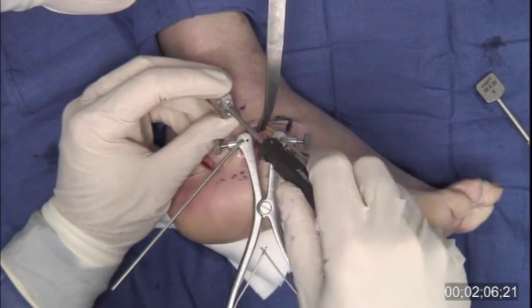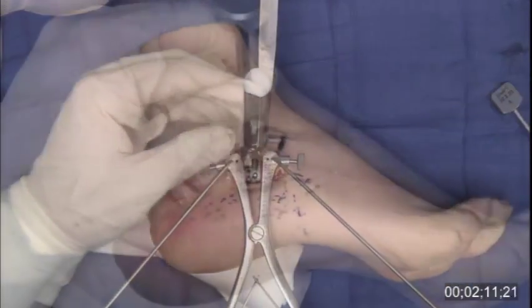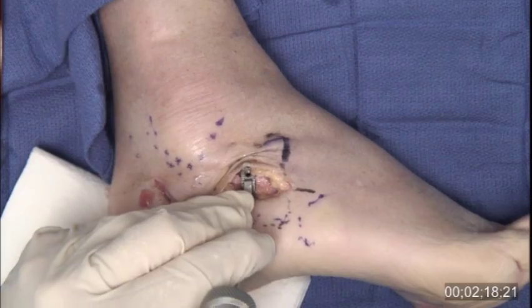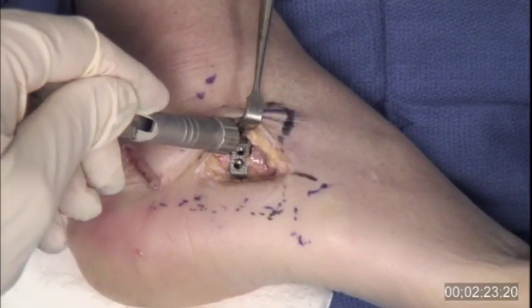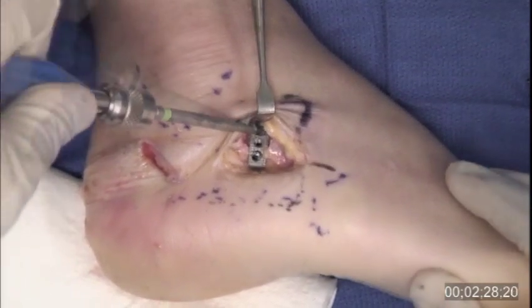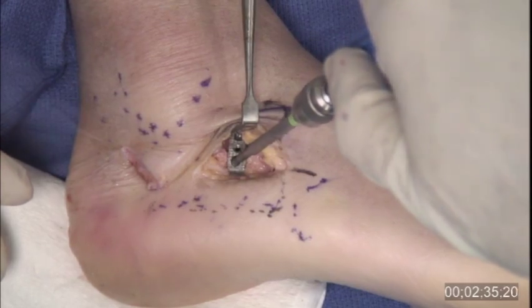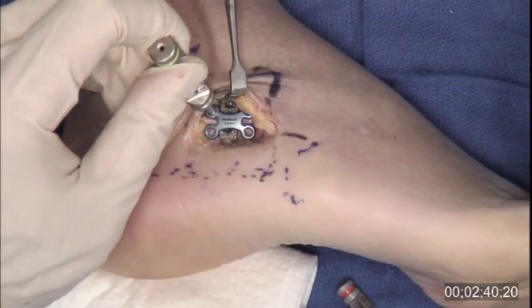The threaded inserter facilitates wedge placement and, if necessary, revision. Fine tuning of placement is performed with gentle impaction. Appropriate placement is confirmed by direct visualization and by fluoroscopy. Integrated screws enhance wedge fixation. The drill guide places the screw at a preset angle to assist in avoidance of the calcaneal cuboid joint. The Arthrex BioSync wedge is indicated for use with supplemental plate fixation; however, in my practice, I do not find plate fixation necessary.